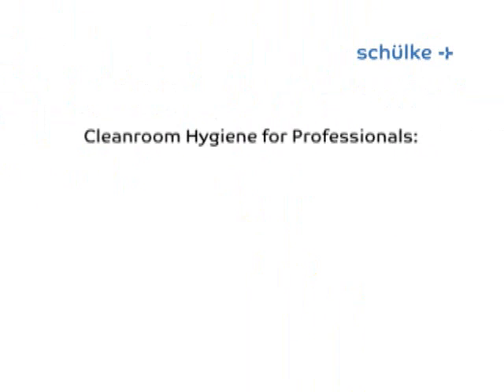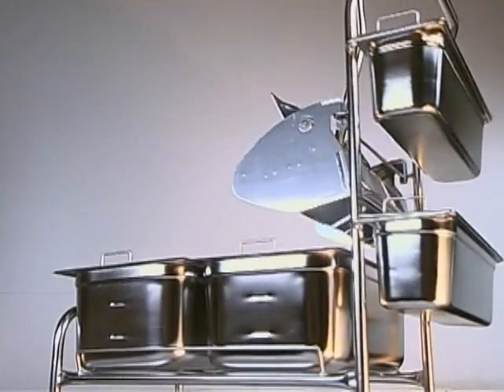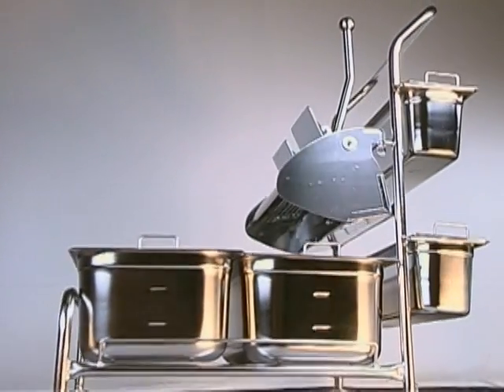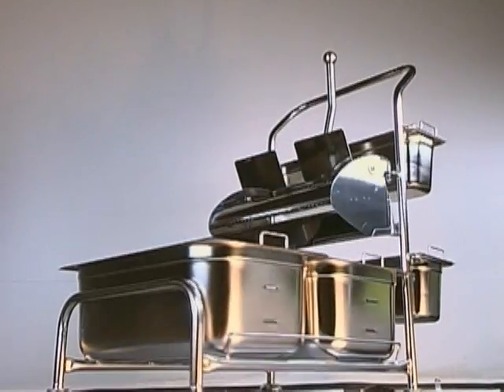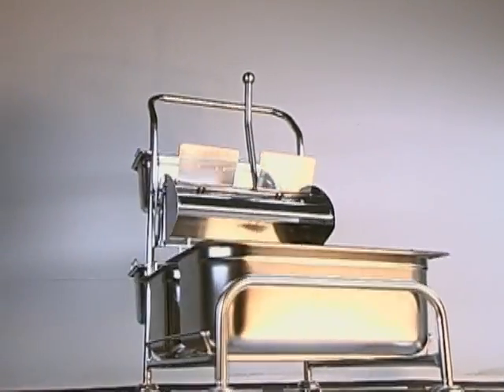Exactly tailored to the requirements in a clean room: the cleaning system trolley. The company Fennig Reinigungstechnik designed a trolley specifically for use in the clean room area, which enables fast and trouble-free working.